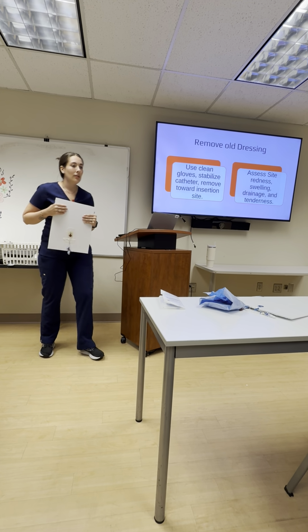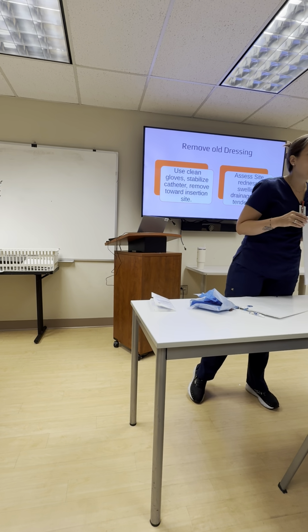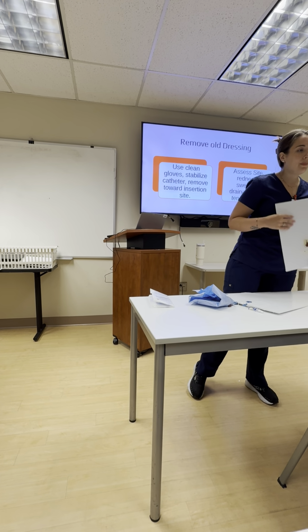If you need help, let me know too. There's an alcohol swab in the kit too. You want to open it? That could help.